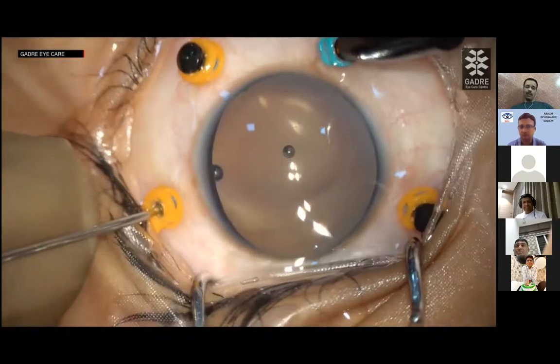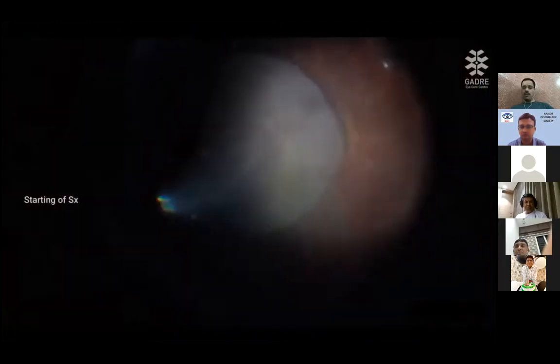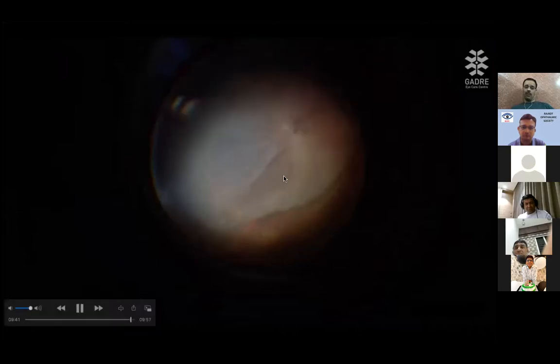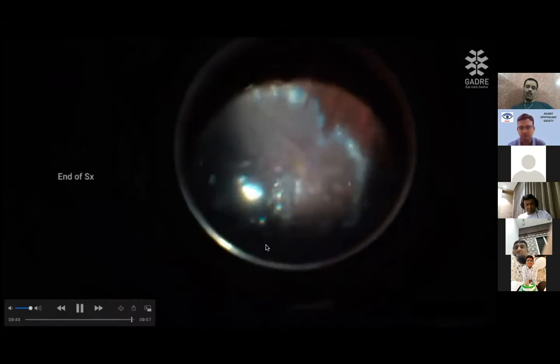This is just two small snippets showing the surgery today, the pre-op. This is the start of the surgery today, showing the lifting up of the nasal and inferior retina. The temporal edge seemed attached. And at the end of surgery, I would like to show a small snippet, just 2 seconds. Again, today I had to do some radial retinectomies here, but was able to reattach the full retina.